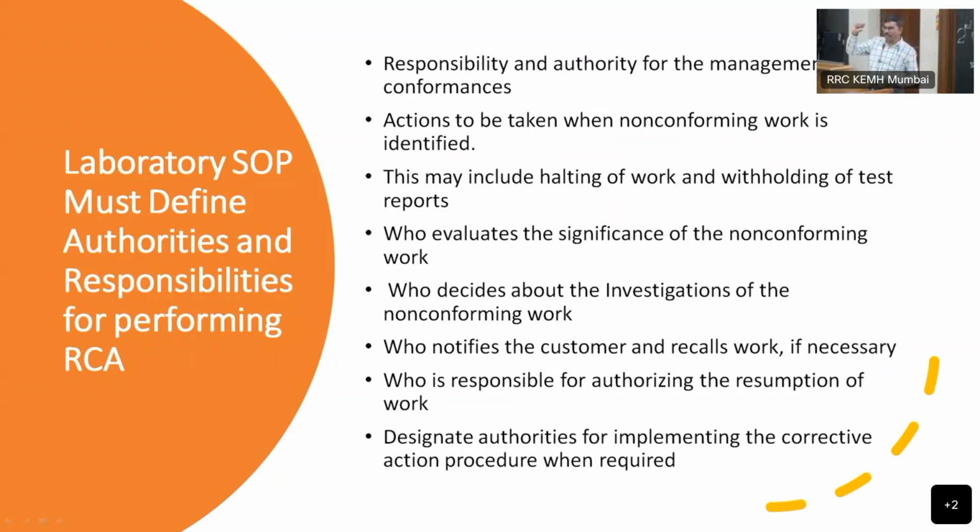Because most of the time what happens is, I used to ask every lab, when they are preparing QC, say 4 ml, 5 ml. So they prepare an adequate amount based on the dead volume of the machine and some aspiration volume, correct? On that basis they make 300, 400 microliter aliquots in small vials and keep them, okay? And they used to take 1 vial each per day, correct? That is the routine.